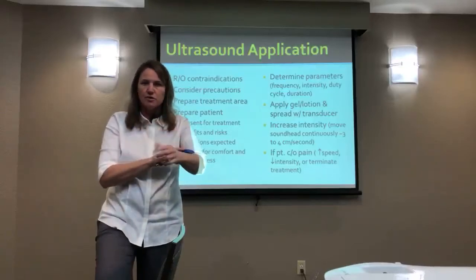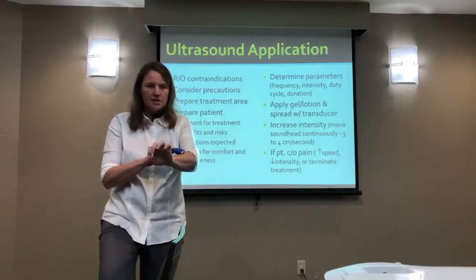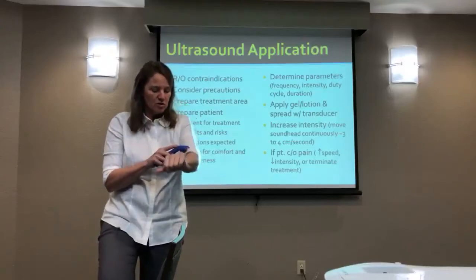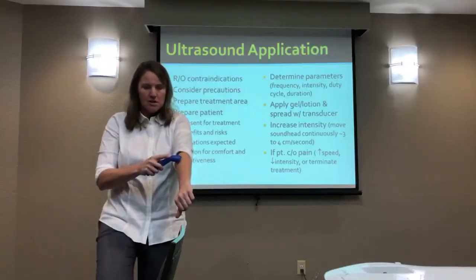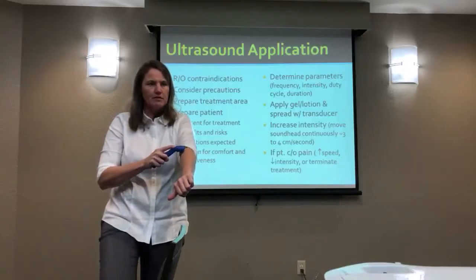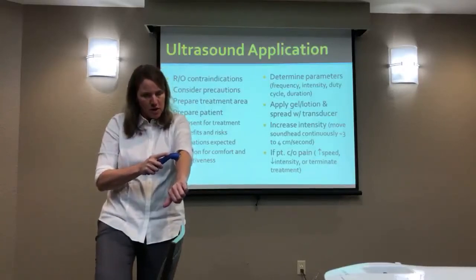You could do it on yourself or on a partner, and set the machine up and get it to a point where you're starting to feel a tiny bit of discomfort. So go kind of slow and kind of small. No bigger than twice the size of your sound head. You have to move. But just get it to a level where it's just beginning to get uncomfortable, and then go a little bigger, and notice how it changes. Then go a little smaller again.